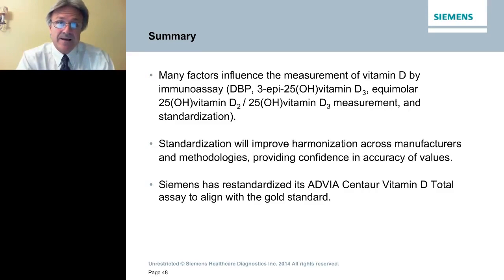I have not tested this in my laboratory yet on a clinical chemistry analyzer. It's all going to come down to the ability of the polyclonal antibody used in that to equimolar measure vitamin D2 and D3. In addition, the EMIT technology does have limitations on sensitivity. So I would be wondering how the analytical sensitivity was measured by that immunoassay. It does propose a challenge, running a homogeneous test for vitamin D, but I've not used that method in my laboratory.